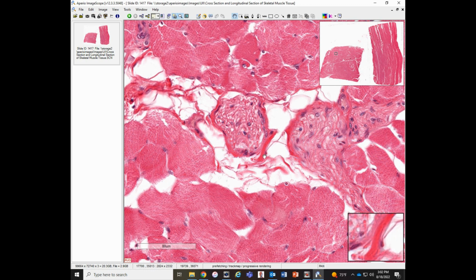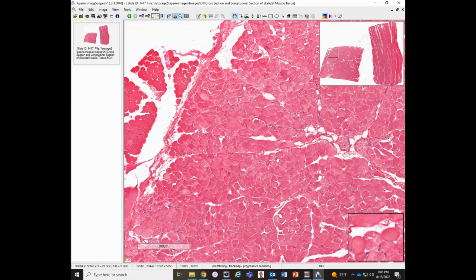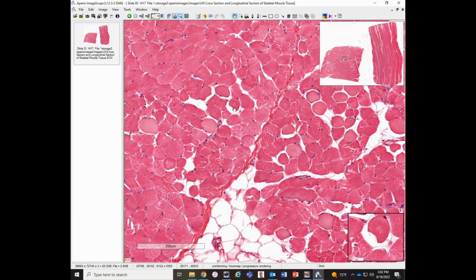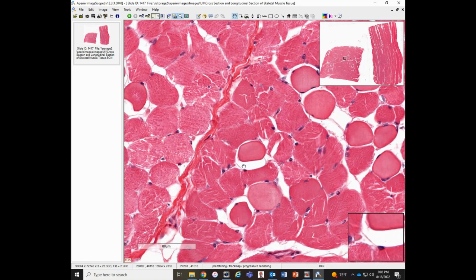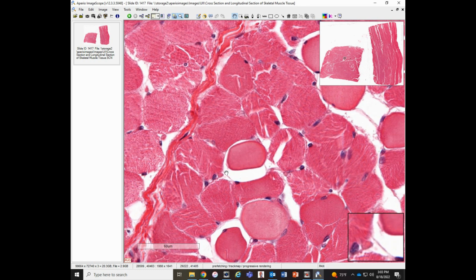So here we have a peripheral nerve that's invaded the muscle to terminate on those actual muscle cells and cause them to contract. If we look closely here, a few of these nuclei have shrunk, but that gives us a chance to see the very, very slender endomysium. This little tiny strip right here is that connective tissue surrounding an individual muscle cell. So an individual fiber surrounded by that endomysium right there.